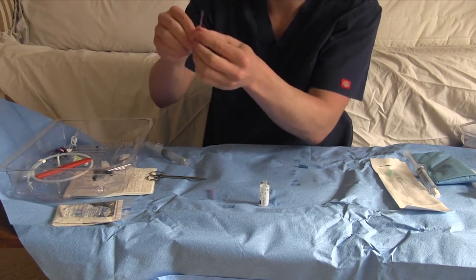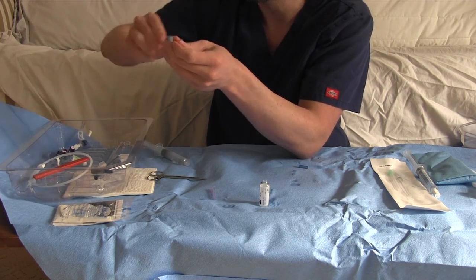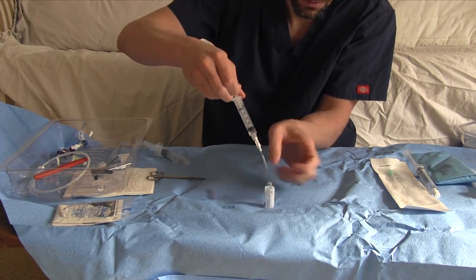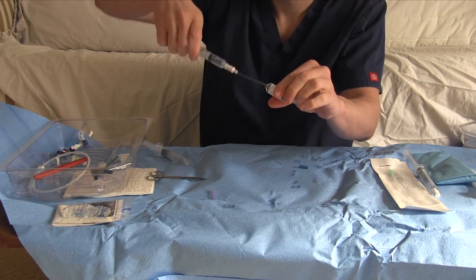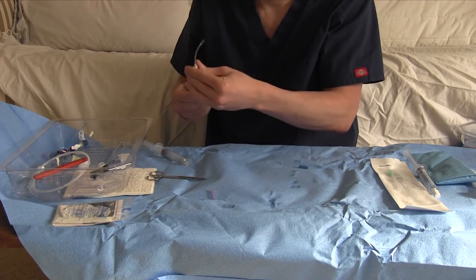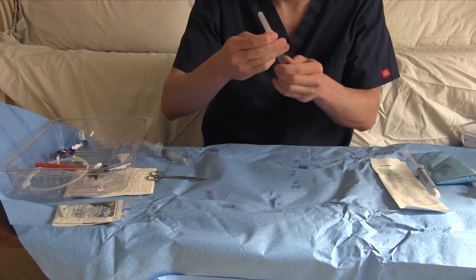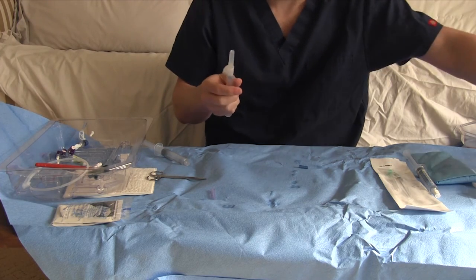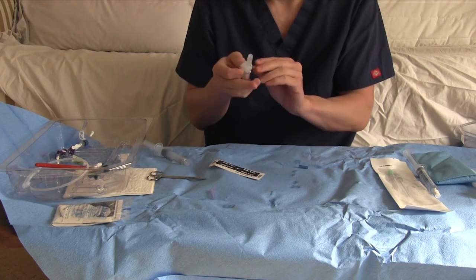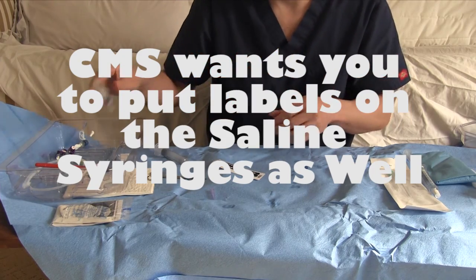And then there's this long tubing that you could use to draw it up without having to stick a needle in there. So let's draw up our lidocaine. And that's nice. We got our lido. All right, there's a little anesthesia needle in there. And if you want it to be cool, you can actually put a lidocaine label on it, which I think is kind of neat. There you go. You got your labeled lidocaine.